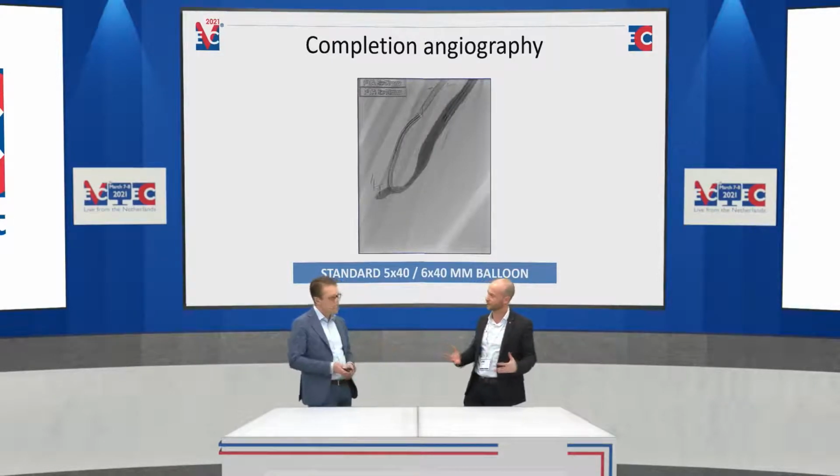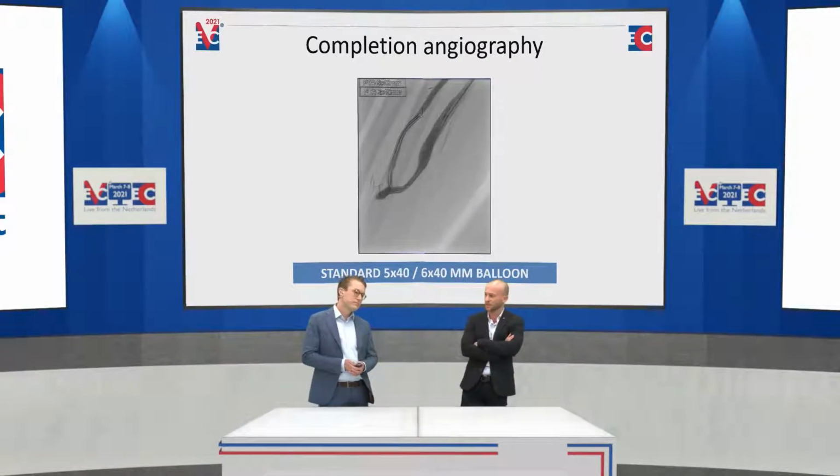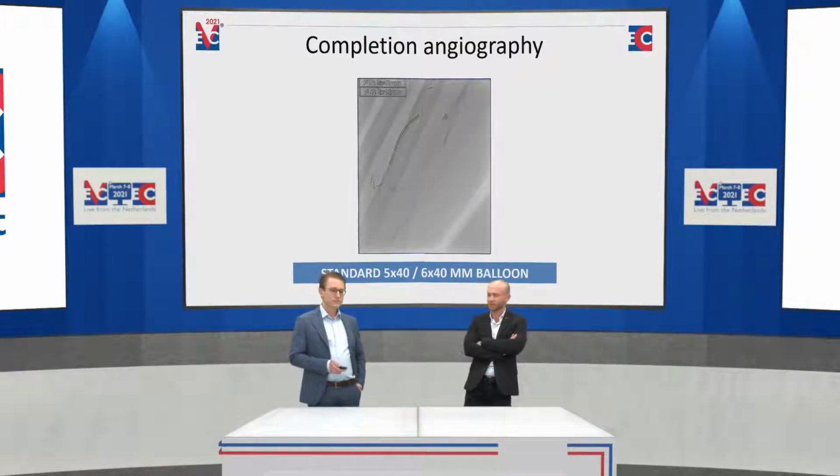Larger and larger. It gets larger and larger. So that's one benefit of the high pressure balloon, of course. It's a non-compliant one. So that's one reason. If you want to stay up at 6 millimeters, then you use the high pressure balloon.